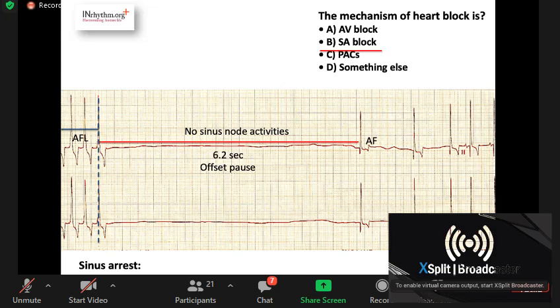So this patient was having an atrial flutter. That means there was regular atrial activity going on through a macro reentrant circuit in the right atrium or the left atrium. And that atrial flutter circuit broke. But the sinus node was so sick, it was completely dependent on the atrial flutter rate. So the sinus node is still sleeping. After an atrial fibrillation or an atrial flutter terminates, if the sinus node is not active, it is still sleeping, then you can have a terrible pause.